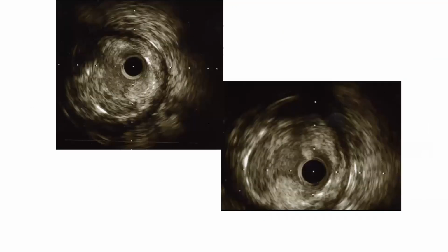Okay? And this is an image here of a patient who presented with MI. This is an IVUS image. So you can see here the stent struts. And what you can see inside the stent, you can see that you have this dense white echogenic structure that is significantly stenotic. All this is neointimal hyperplasia. But you also have that big structure here.